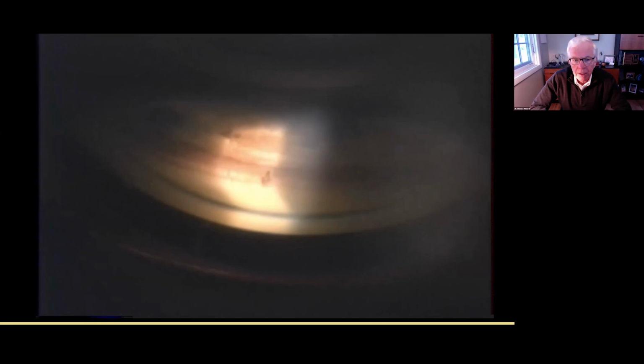This is a patient who had intermittently blurred vision. We happened to catch him right at the time when we could see him bleeding from his old cataract wound. It's a pretty cool video.